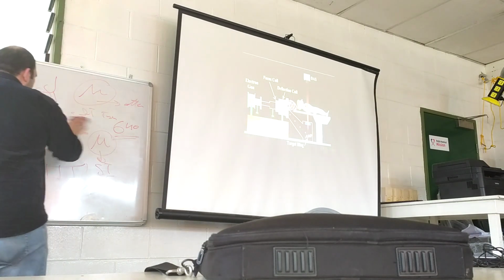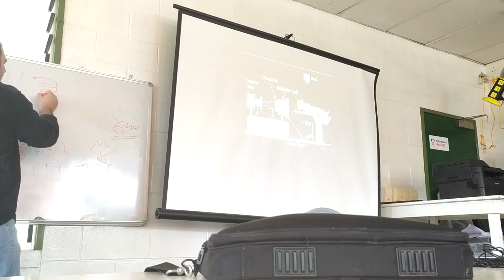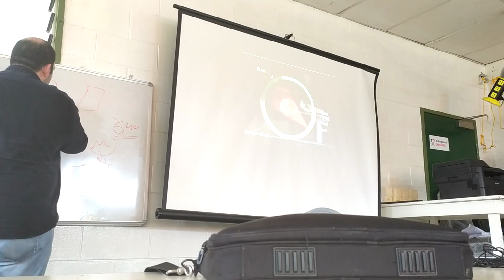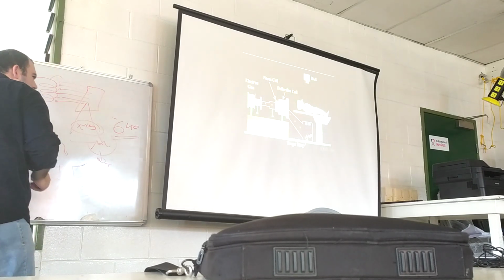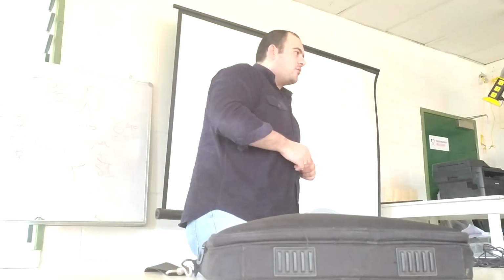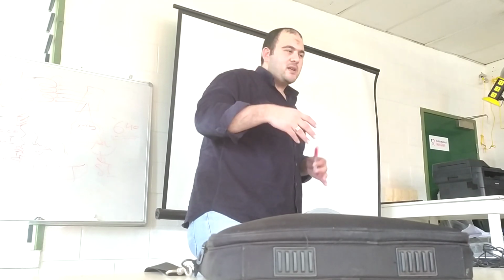For X-ray production, you have to use a cathode and an anode. The cathode is important for producing electrons, which move from the cathode side to the anode side. After that, the electrons interact with the anode to produce X-ray. We have 2 types of X-ray, characteristic X-ray and Bremsstrahlung X-ray. The most important is Bremsstrahlung X-ray, which is used in X-ray, CT or CR. Only in mammography do we use characteristic X-ray. This is physics detail, not important for us, but you have to know.